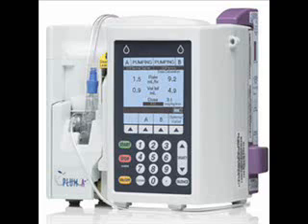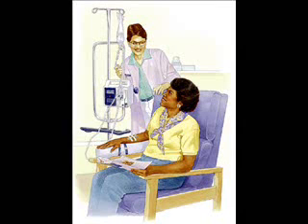Infusion pump. An infusion pump is a medical device that delivers fluids, such as nutrients and medicaments, into a body in controlled amounts. Infusion pumps are in widespread use in clinical settings such as hospitals, nursing homes, and in the home. In general, an infusion pump is operated by a trained user who programs the rate and duration of fluid delivery through a software interface.